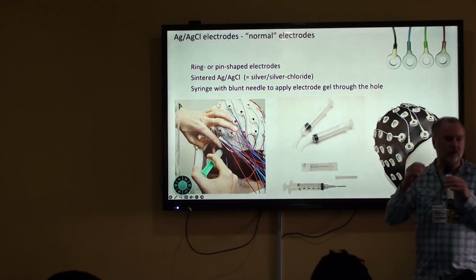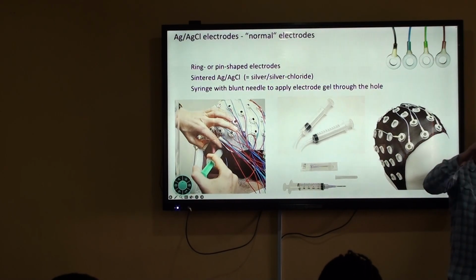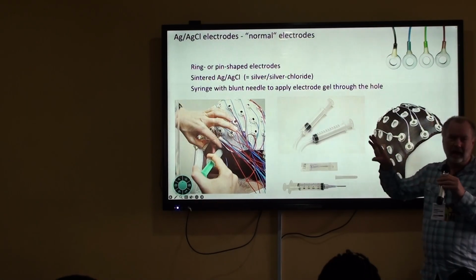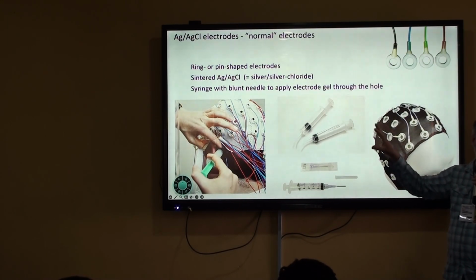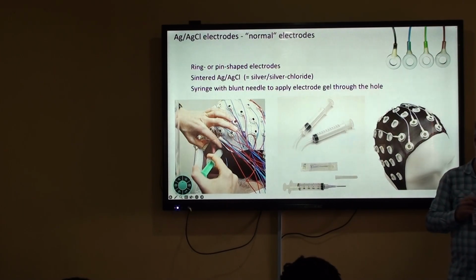If you use the salt water based electrodes, it's the salt water that needs to touch the scalp, and the only way that you can get the salt water to touch the scalp is by having the sponge touch the scalp. So I suspect, but I don't have the hands-on experience, that electrodes with gel work with the most diverse types of hair, because of the ability of bridging the distance between the scalp and the electrodes using the syringe by squeezing while you're retracting the syringe.